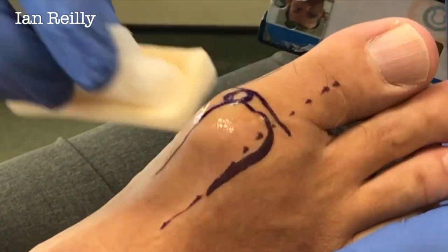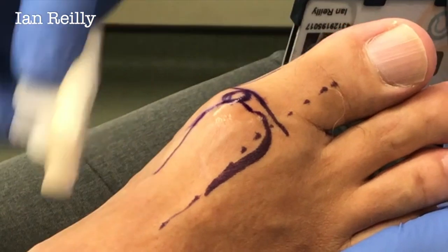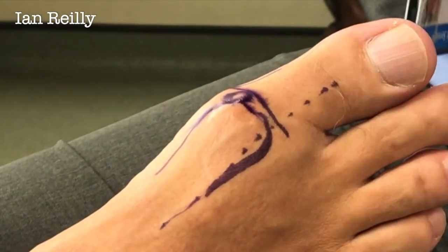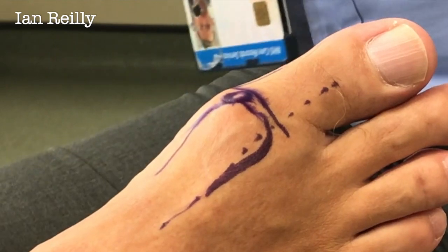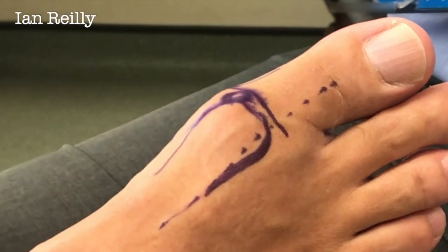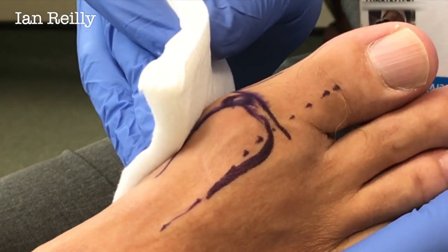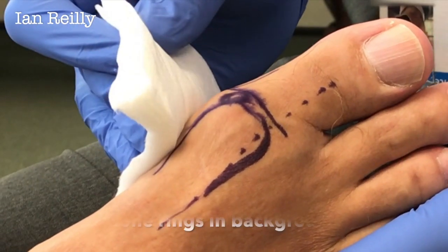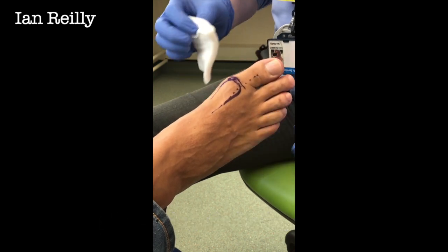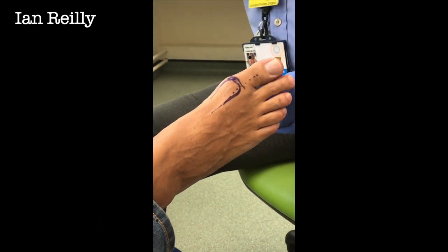Okay, and a little bit of gauze. The gauze is... did I just get a message on the phone then? Is that yours or mine? It's mine. Okay, that'd be great if I get a phone call from the bank saying you've spent all your money again.